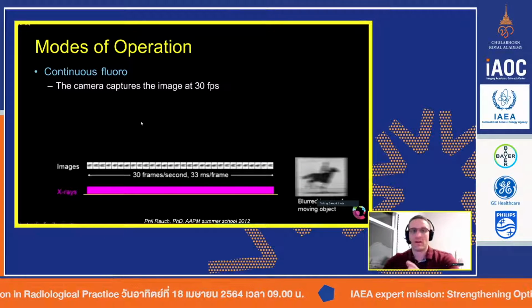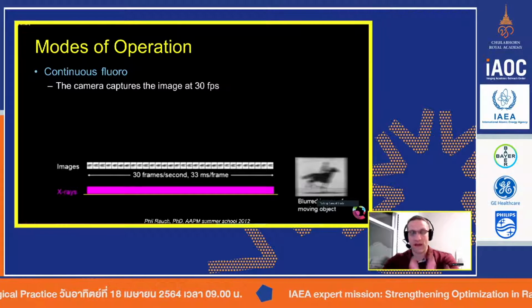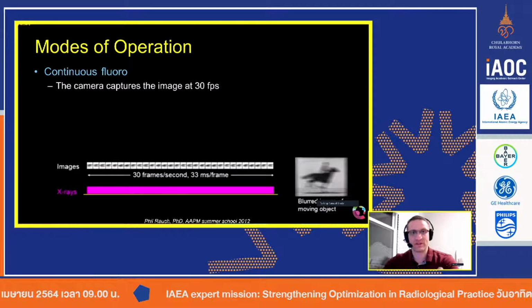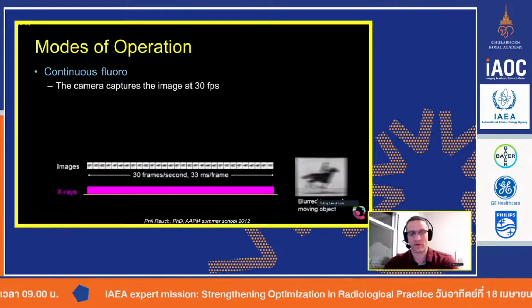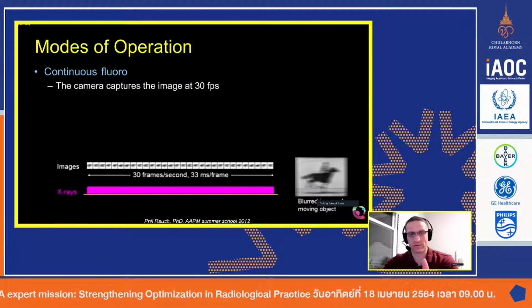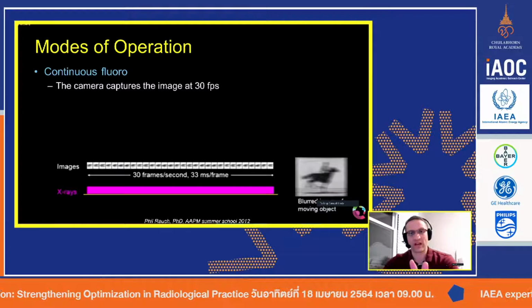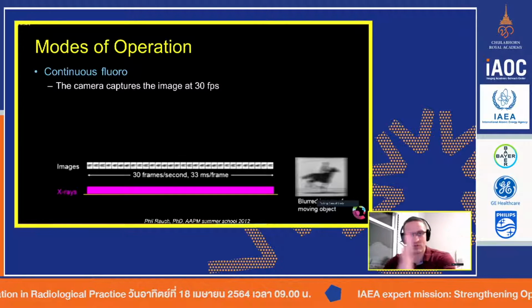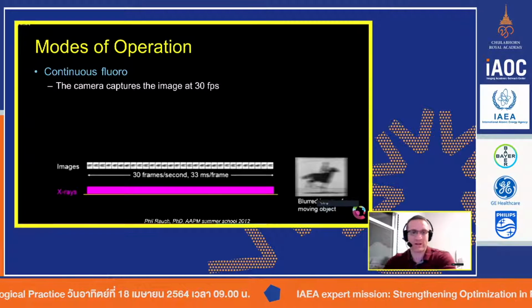So when we deal with mag modes, it depends on the type of detector. There is definitely a dose change for the II mag modes, and there is a slight dose change for flat panel. But they're both doing that in order to keep the image quality, the signal to noise ratio, the same as it goes from low mag to high mag.